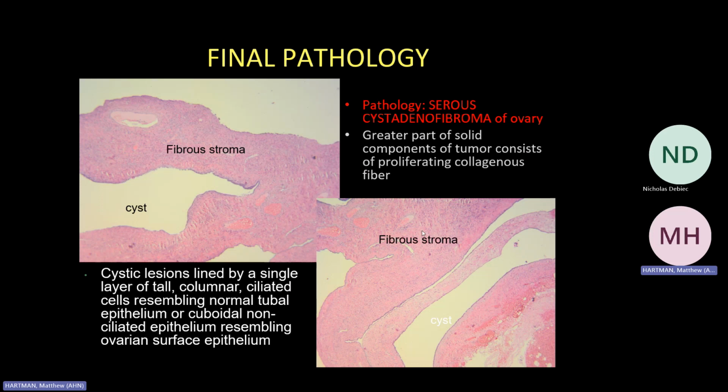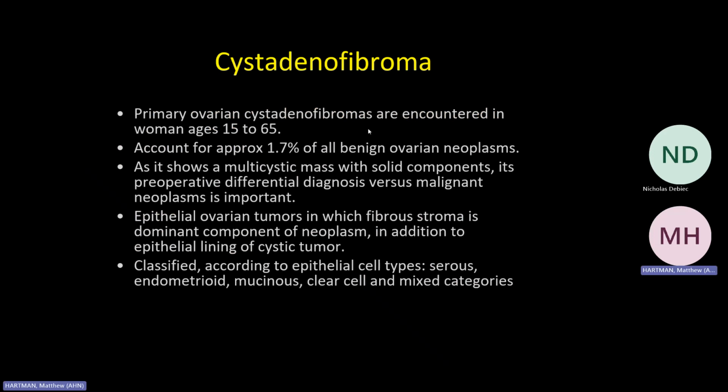Again, this is a microscopic diagnosis. And you can read a little bit more about cystadenofibroma.